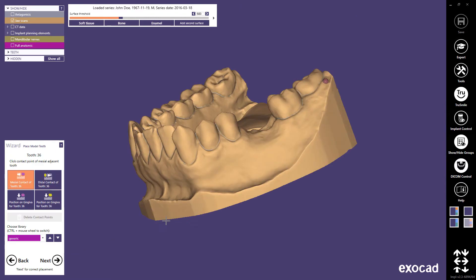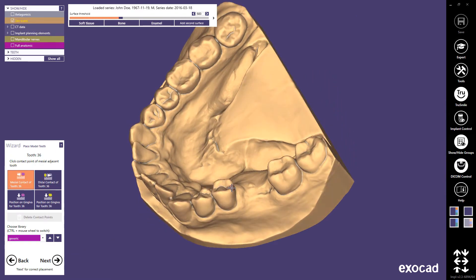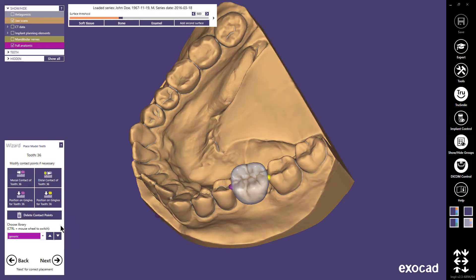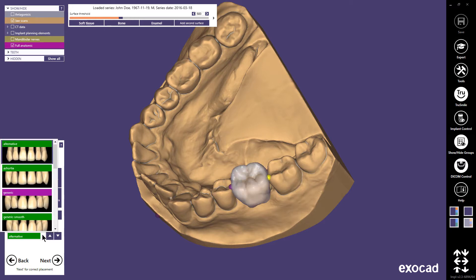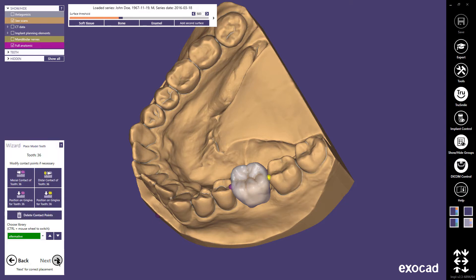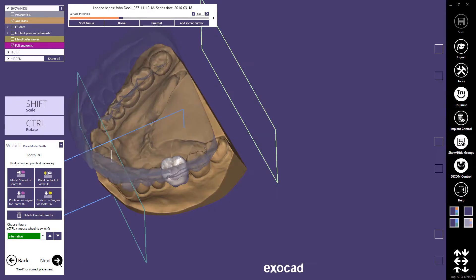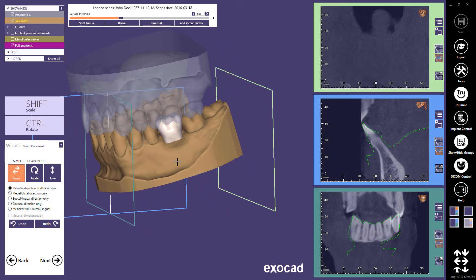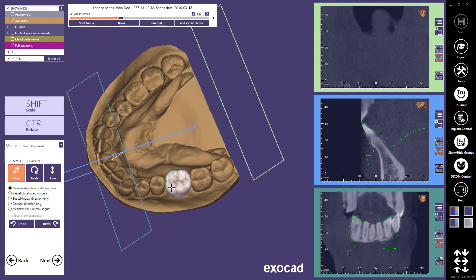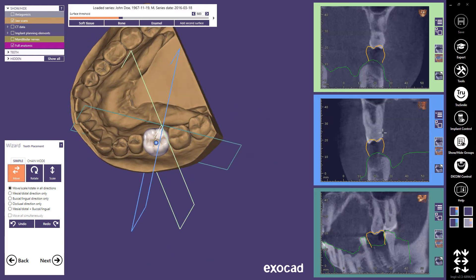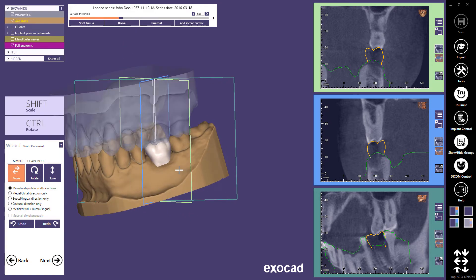In the next step, I can place a model tooth to be used as a guideline when placing my implant later. Just place the tooth roughly with two clicks. The placement can be corrected in the next step. If you want, you can change the library to get a different tooth shape. Continue with Next. In the tooth placement step, you can correct the placement using both the 3D view and the secondary views. The tooth placement will be explained in detail in a separate tutorial. Continue with Next.